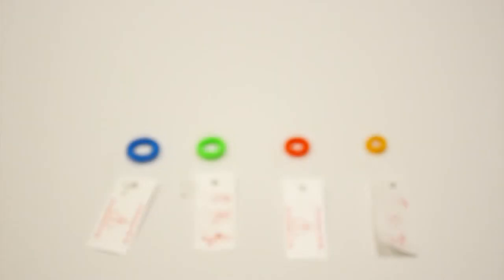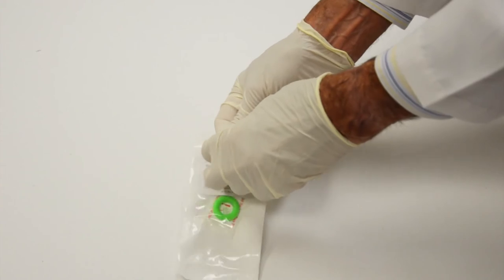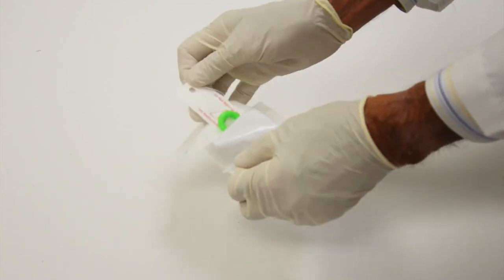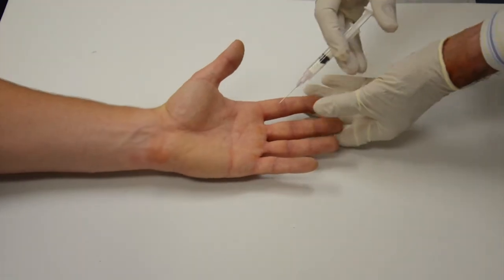The four bright colors indicate the four different sizes. To apply the tourniquet, simply remove from its sterile package and roll onto the finger or toe, blocking the digit if necessary.